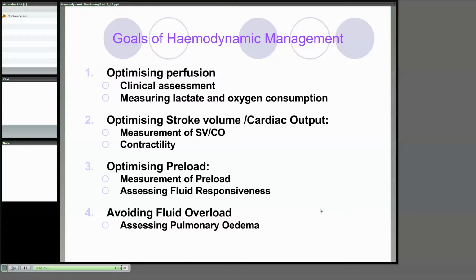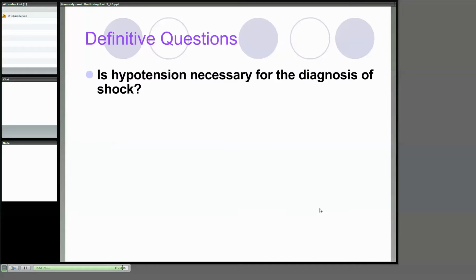I know that in some units, and you know this one here too, they like to run their patients very dry. So they'll allow the patients to slip down the curve a bit if their cardiac output is okay. And some patients who've got very big floppy hearts will only have a very small window of filling, like they'll only need 125 mils to suddenly be on top of the curve again. And that's what we're seeing a lot of now, so that's why we're very cautious with our fluid and our fluid boluses to avoid pulmonary edema.